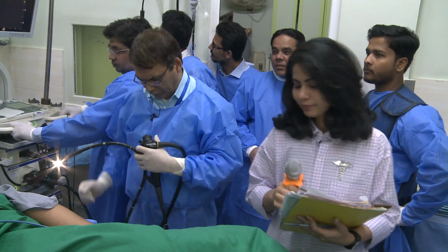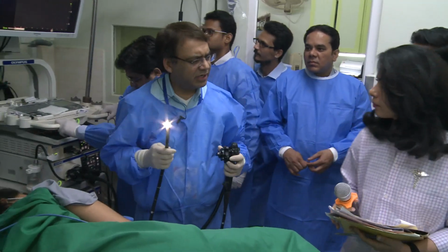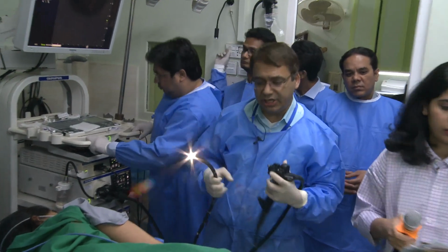Thank you. Do we know the etiology of the pancreatitis? Khalid. Gallstone pancreatitis? Can you hear me?